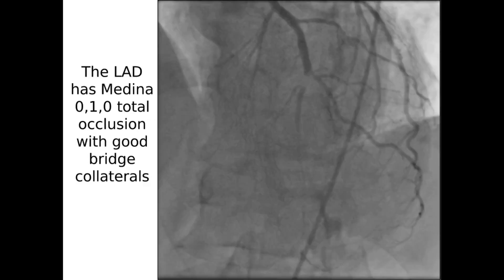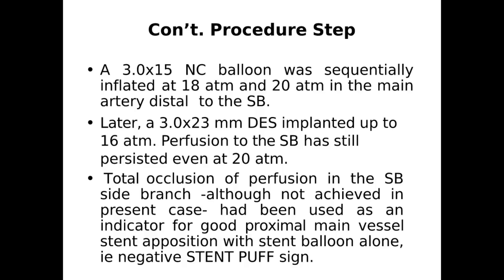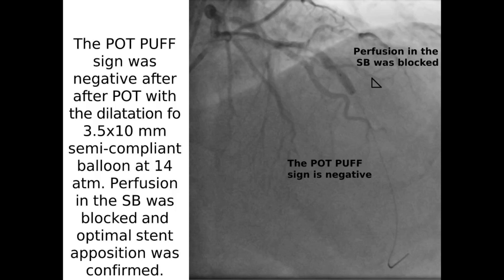The technique has two steps. The first step is stent puff, performed after lesion preparation. This is a CTO lesion and the side branch is present. We implant the stent at optimal pressure, and at the time of balloon-stent balloon dilatation, we introduce some contrast medium. As you can see, the contrast medium penetrates into the side branch.